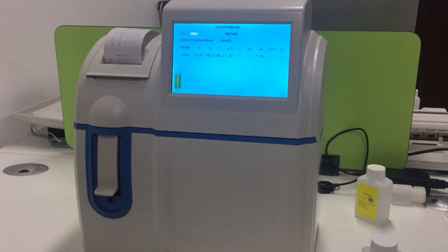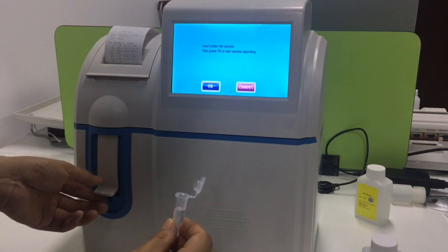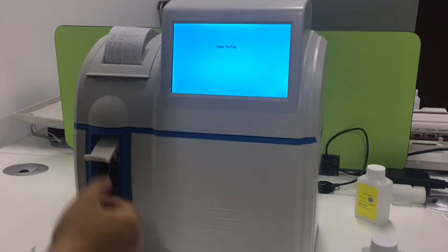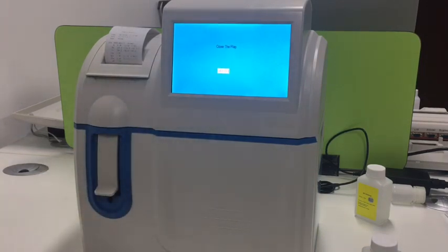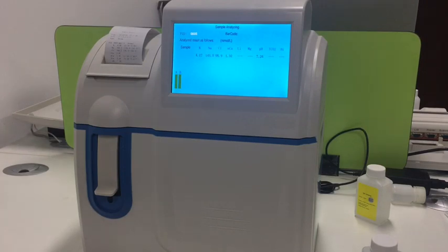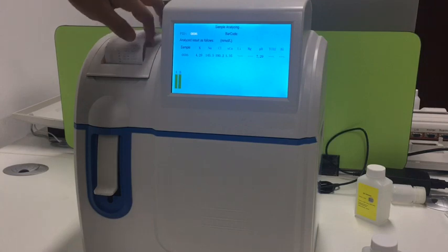This one is finished. We can do the second and third runs using the same procedure. After correction, I did three times total. Now we can note them down.